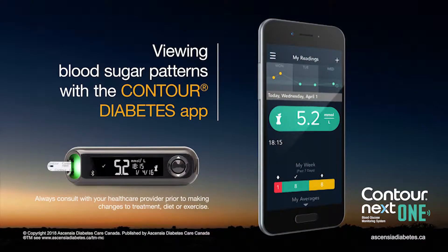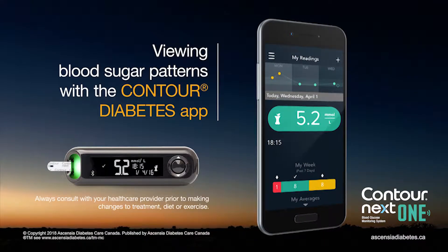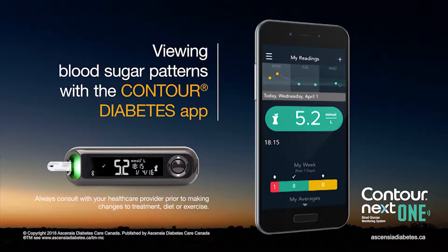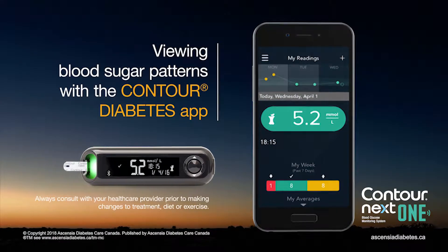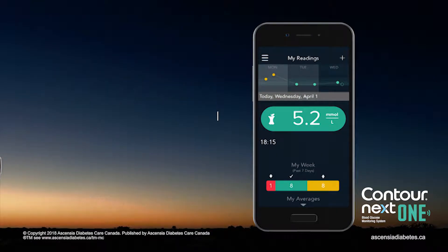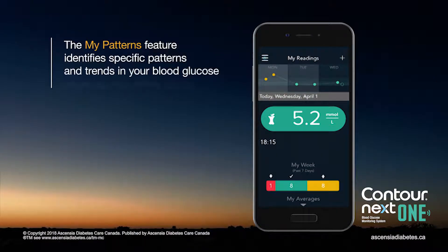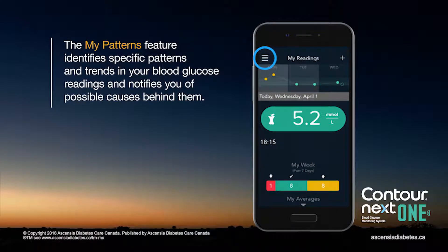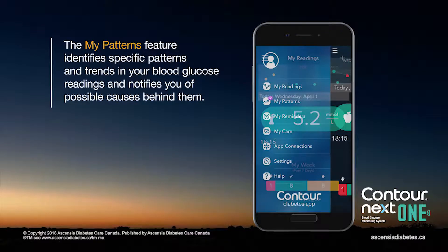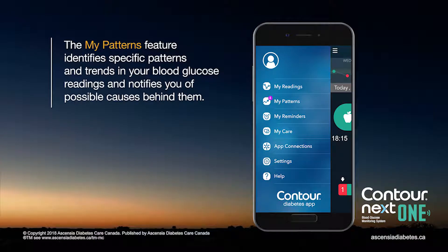This video will show you how to view your blood sugar patterns with the Contour Diabetes app. The My Patterns feature identifies specific patterns and trends in your blood glucose readings and notifies you of possible causes behind them.